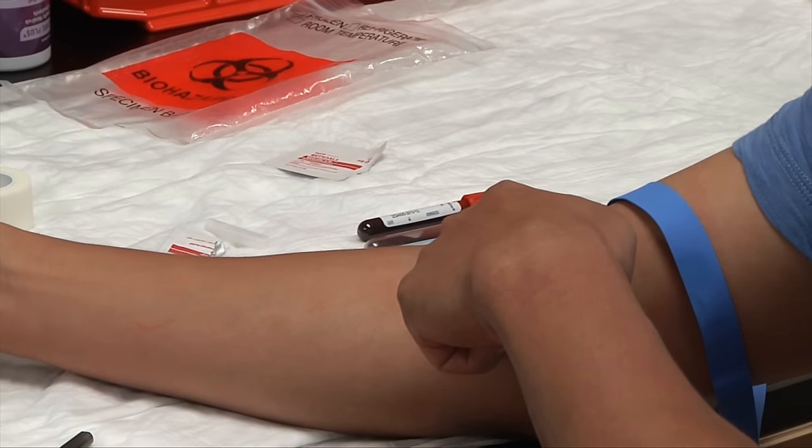Tell your patient to keep the tape and bandage on for about an hour. At this time, invert your tubes four to six times, slowly. If you invert your tubes fast, hemolysis is likely to occur, so go slow to mix the chemicals into the blood. Then place your labels on the tube with the date, time, your initials, and the patient's name. Place your tubes into the lab bag and carry to the lab. You may also use the pneumatic tube system if your facility has one, but be sure to pad the tube appropriately. And this is how you do a straight draw.